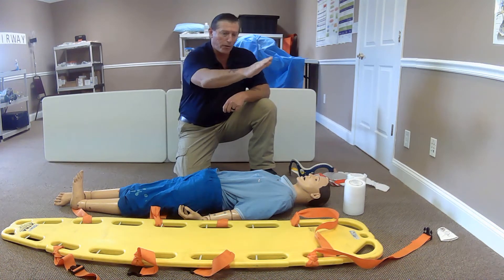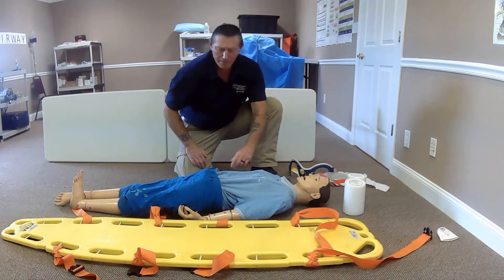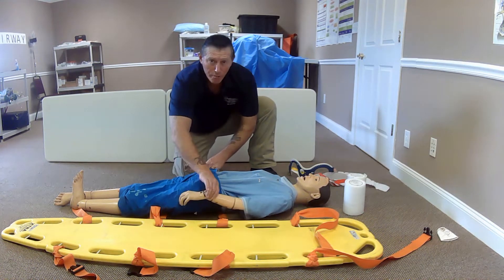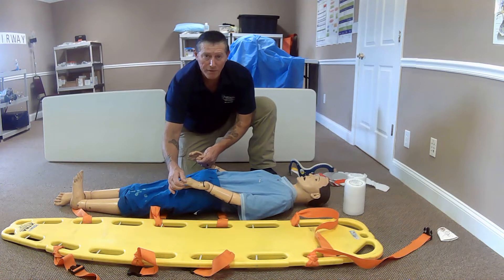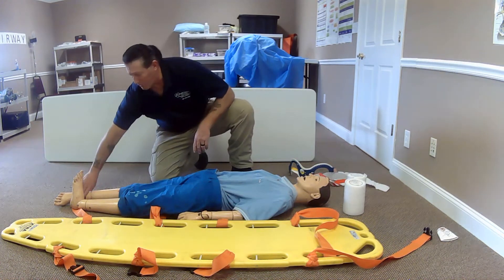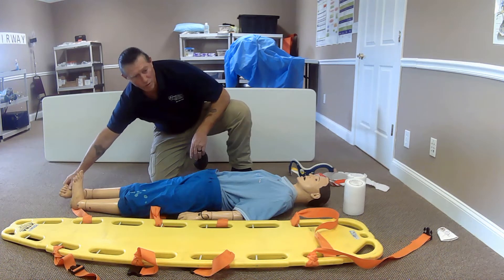I'm going to direct my partner to maintain manual stabilization of the cervical spine. I'm going to assess my patient's radial pulses and motor sensory. Can you move your hands? What fingers am I touching? I'm going to check my distal pulses. I will check the pedal pulse — present. Can you move your foot? Which toe am I touching?